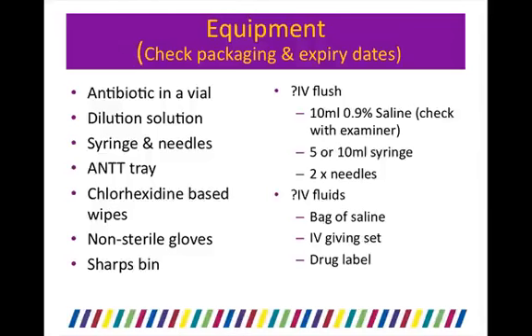The equipment you require: antibiotic in a vial, probably a dilution solution depending on the type of antibiotic, a syringe and needles, an ANTT tray, chlorhexidine based wipes, non-sterile gloves and a sharps bin. If you're giving it as an IV push, you'll probably need an IV flush, which will require you to have a 10ml syringe, 10 ml of saline and a couple of needles. If you're giving it as an IV infusion, you'll need a bag of saline, usually 100 ml, an IV giving set and a drug label.